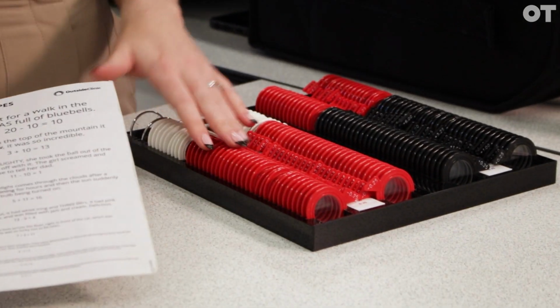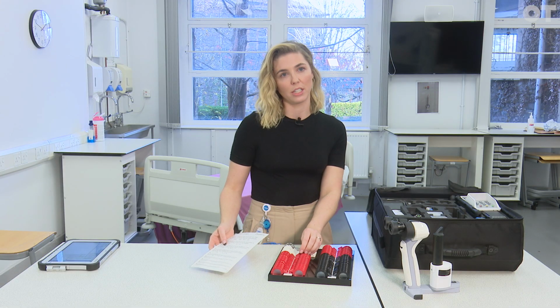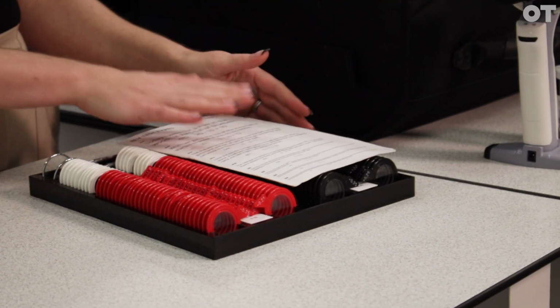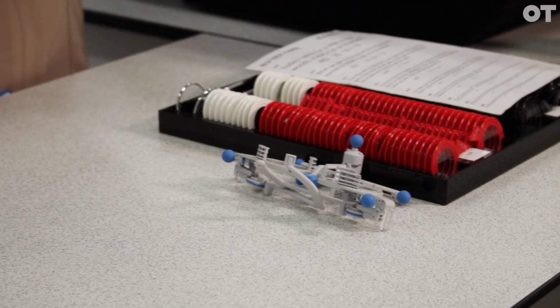We choose if we want plus or minus cyl. The stronger lenses are condensed so you go up in diopter changes instead of 0.50s. Just makes it easier rather than bringing a massive trial set out. Obviously a reading card. We've then got our trial frame to go with that.